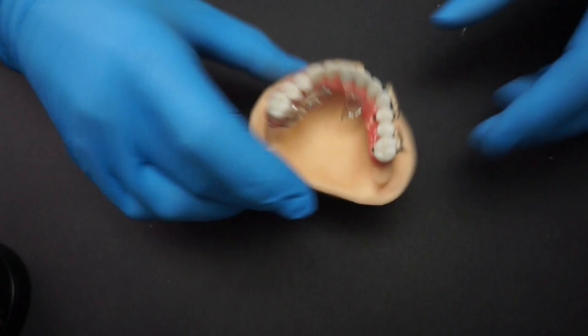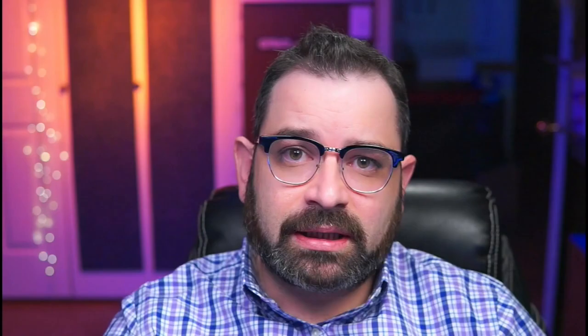Once you have applied all layers of composite, go ahead and step cure it. If you're doing several layers, do a step cure between each one. Since I'm only doing one layer, I only need to cure it once for one minute in my Labileye Duo. Once that's completed, I'll apply my air barrier over the entire surface of the prosthesis, making sure all composite areas are covered, then place it back in the curing unit for an additional three minutes to cure completely.